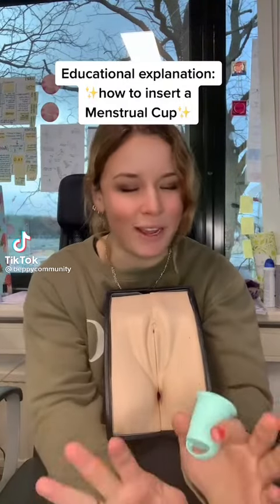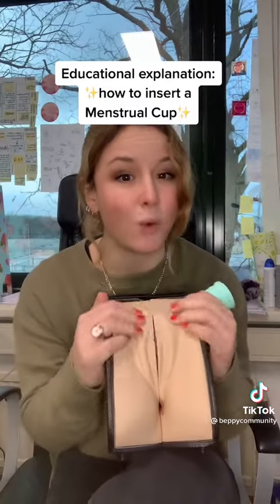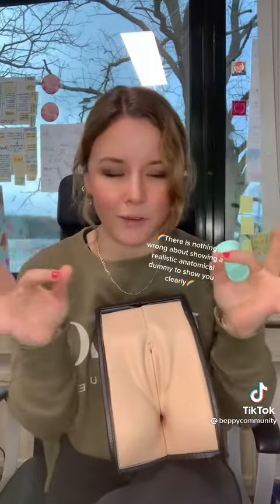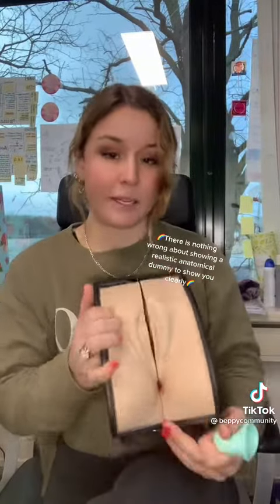Hello everybody, this video is for educational purposes only. As you can see, I have a real dummy representing the vagina so I can show you specifically how to use a menstrual cup. This vagina is completely anatomically correct — it has the vaginal canal, the anus, the urethra, the cervix, and the uterus — absolutely everything. When we close it, it's easier to see exactly how it works.